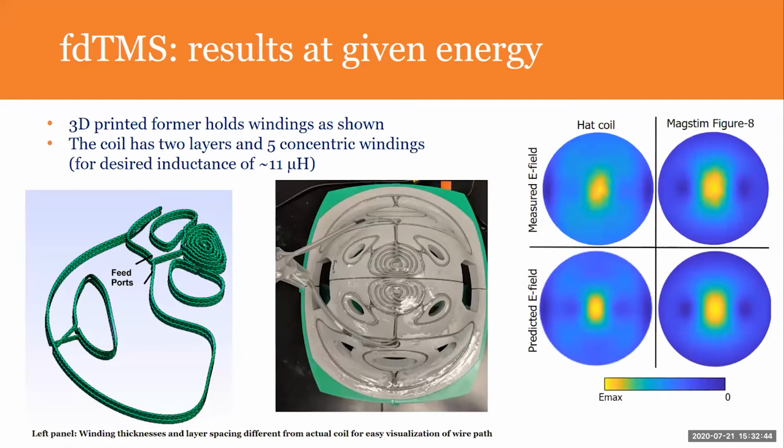And here is then making such coils, which again is something that people were discussing a lot earlier here. So it gets into a 3D printing domain and 2-layer coils. The 2-layer coils there, they at Aalto now have developed 1.5-layer coils.